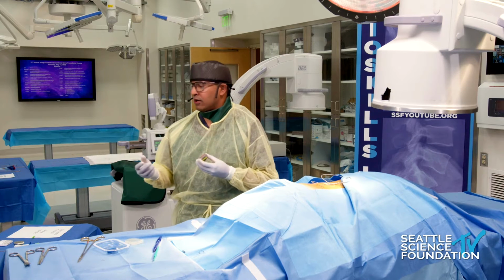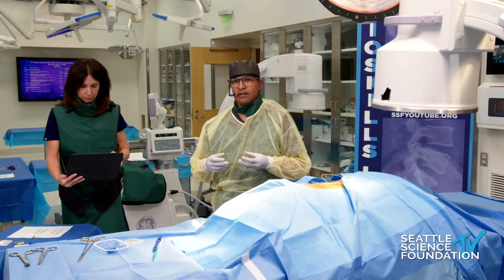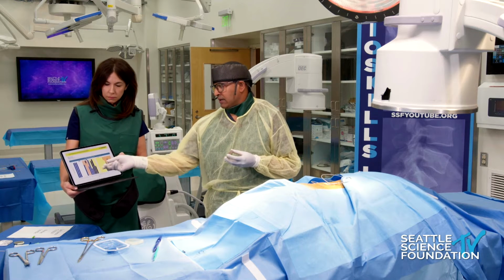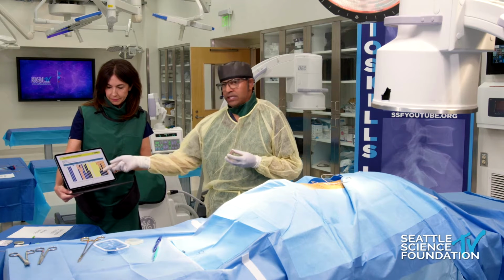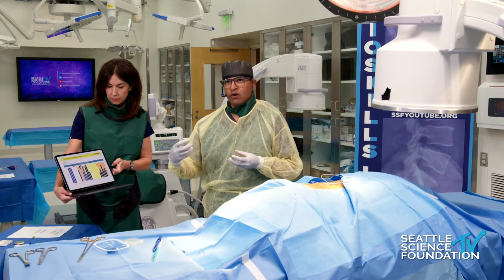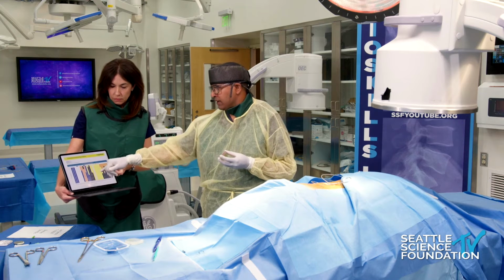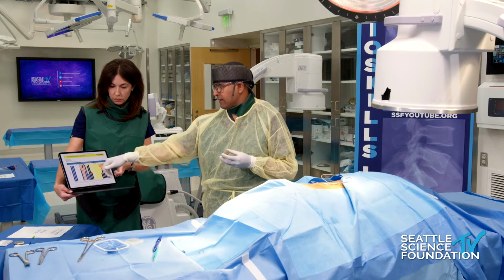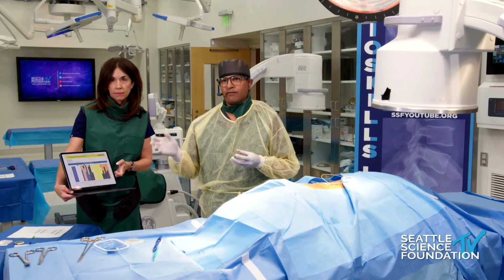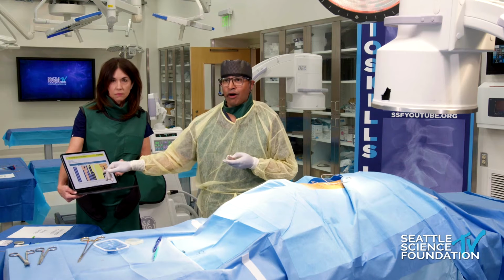So we're going to show you here on the iPad one of the therapeutic monitoring reports, which allows us to see this is a particular patient, and then the x-axis is each day of use. And so the colored bars here are telling us what percent of the time they're using a certain program. And the orange bar is program 6, for example. The yellow bars are program A. So we're able to identify which programs the patient is using, and then similarly, if they even turn it off.